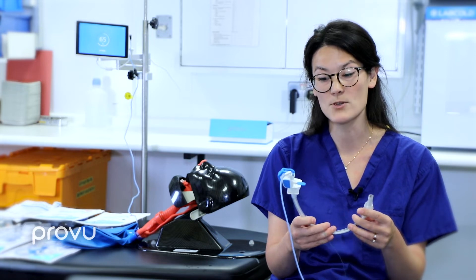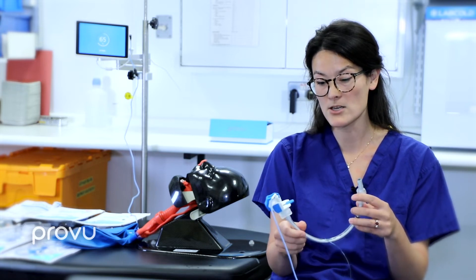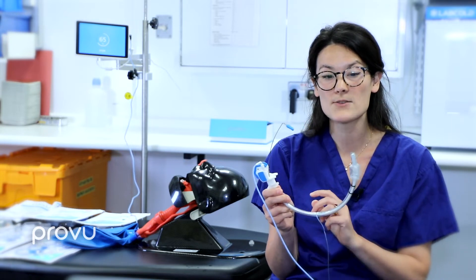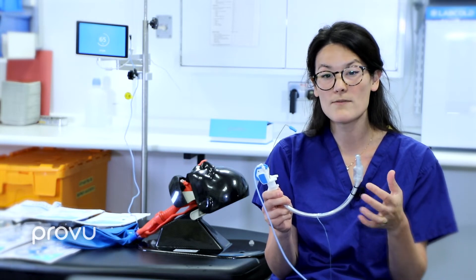This would also be useful when using the device in tandem with a video laryngoscope, specifically a hyperangulated video laryngoscope — you'd want to pre-form the tube to match the angulation of the blade before you start. If you want, you can also remove the internal stilette, which helps with the pliability of the tube. We did this for the ankylosing spondylitis patient in order to really manoeuvre the tube into the airway.